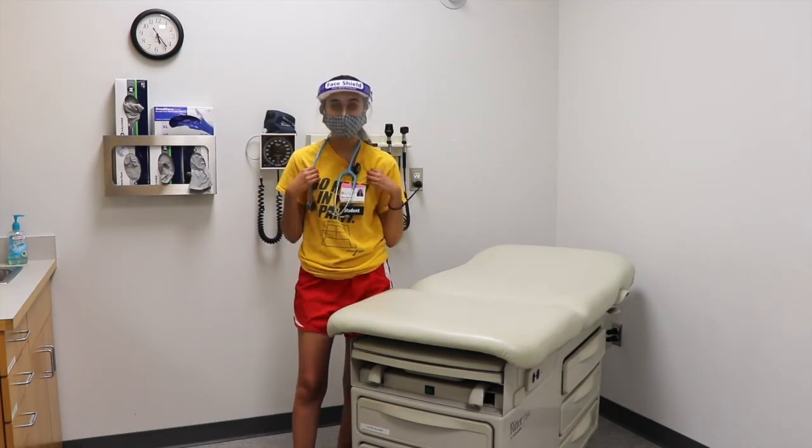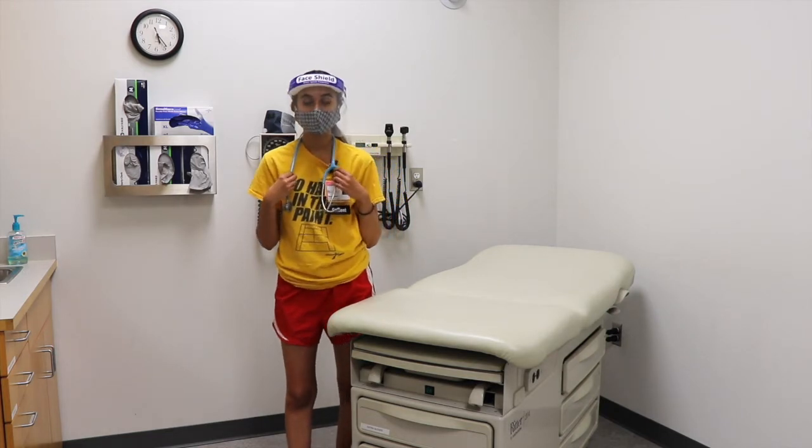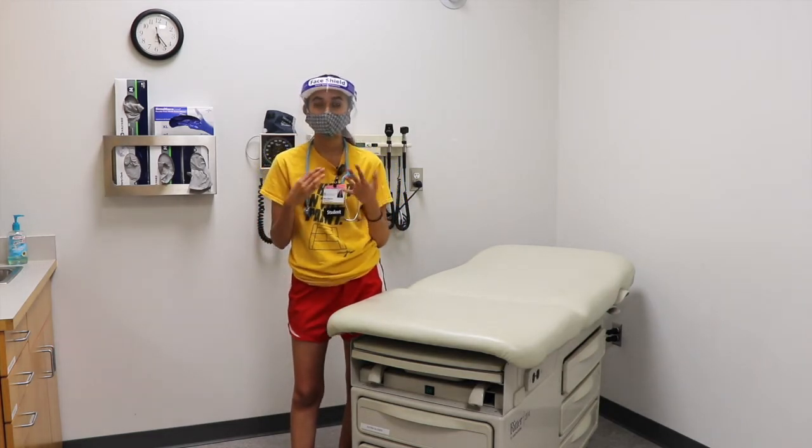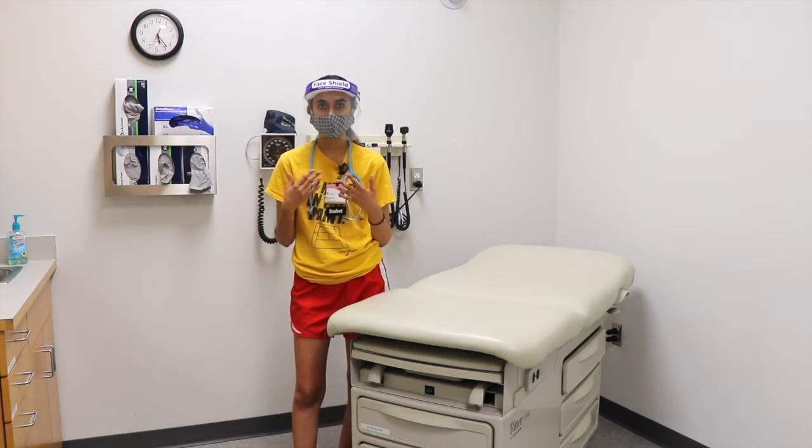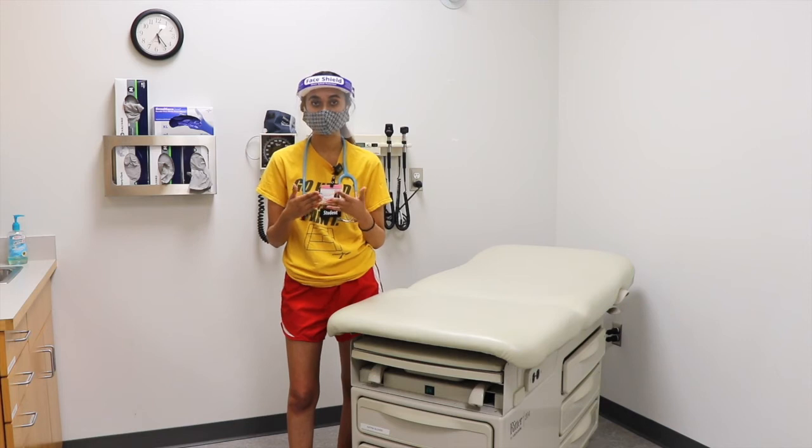Today I'm going to be talking about the different instruments we use to get information such as vitals. We use the stethoscope to get information about your heart. So we use this to see if your heart is working properly. We use it to check your rate and your rhythm. We also use this to check any anatomical defects, such as a septal defect.